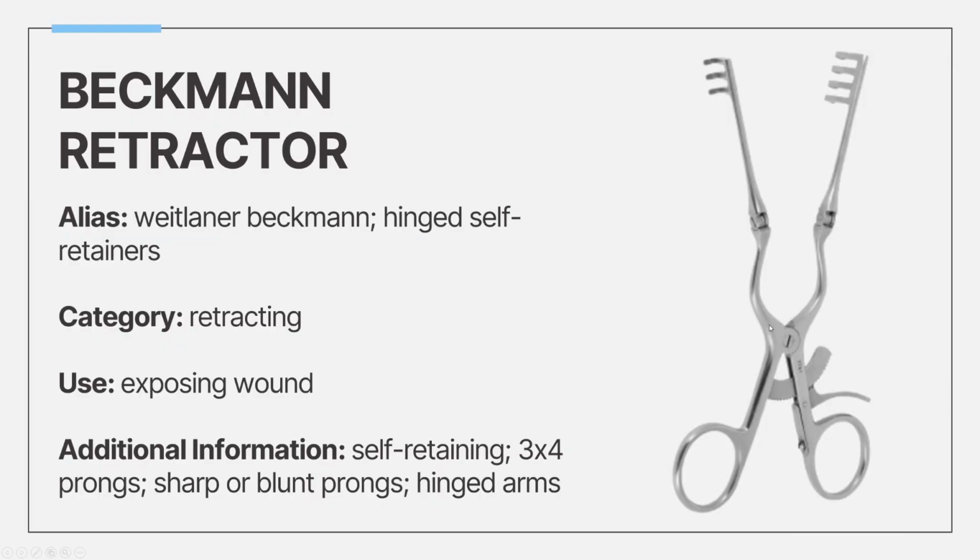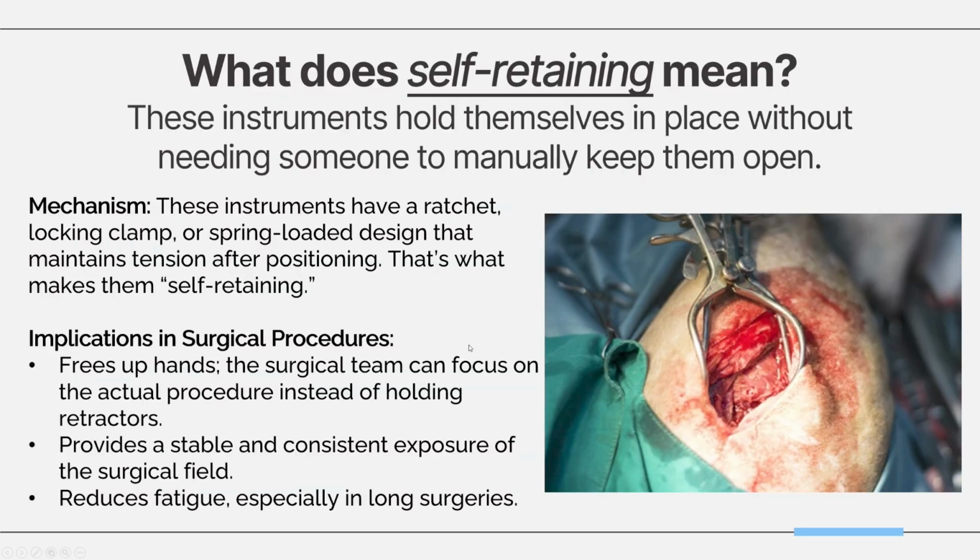They have a lock, as you can see here, so that the surgeon can decide just how wide they want the wound exposure to be so that they can work on it. Some implications: it frees up hands, of course, and it provides a constant exposure of the surgical field. And due to this, it reduces hand fatigue.